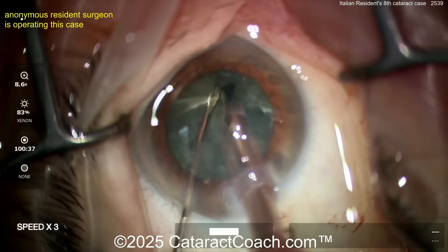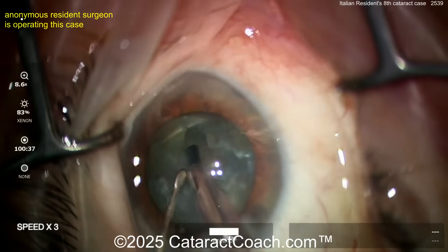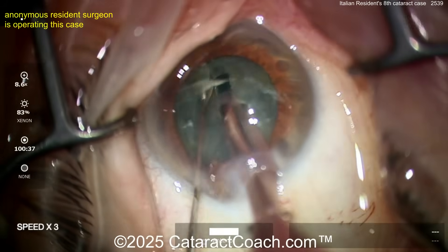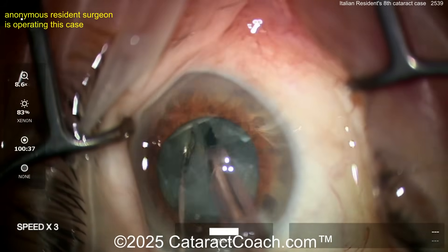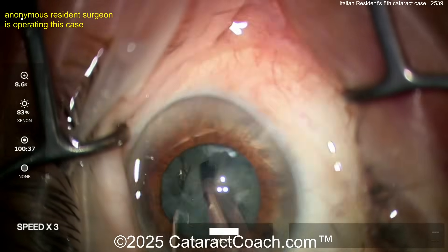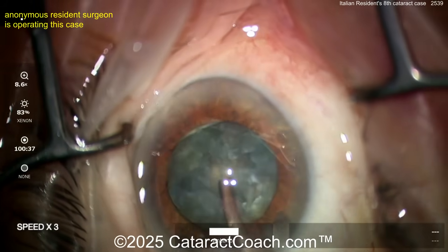See how the eye is not centered in primary? That's very typical for a young surgeon — that's okay. See those three corneal light reflexes, the Purkinje image? You want that in the very center of the cornea. See how the eye is not staying in the center? You want the iris at all times to be parallel to the floor of the room. The iris is not right here, so the grooves weren't ideal, and that's why they're still kind of stuck together — hard time splitting this up.